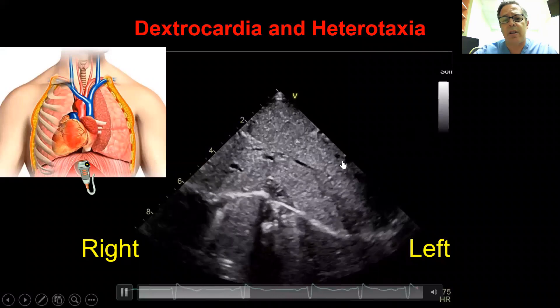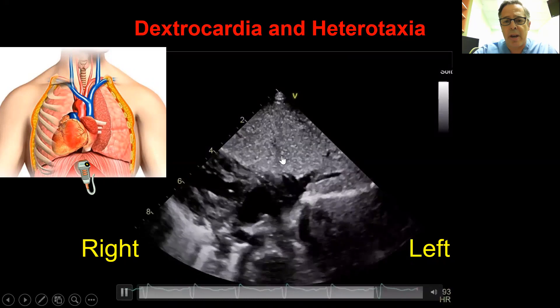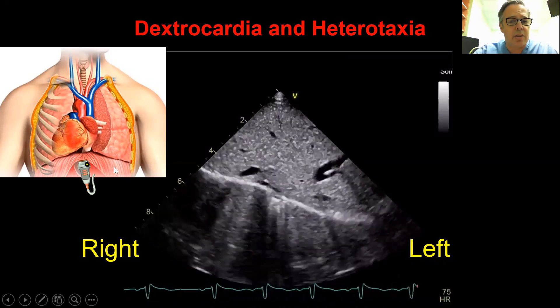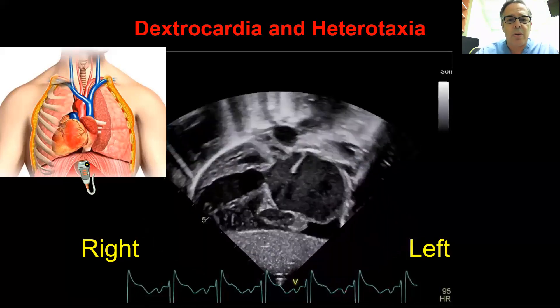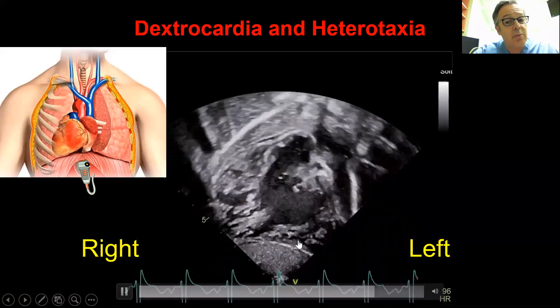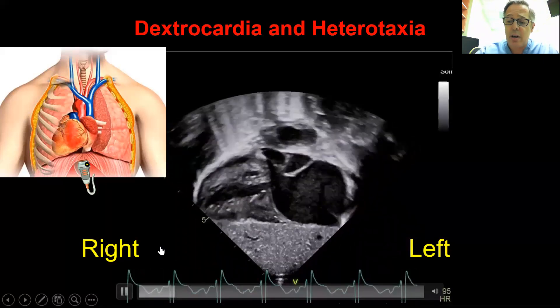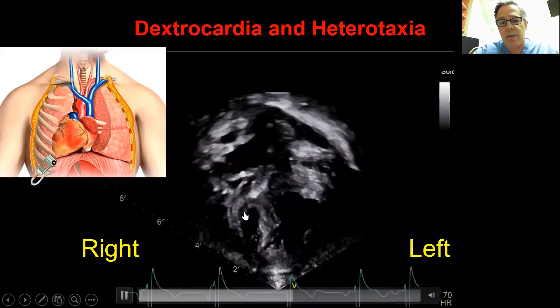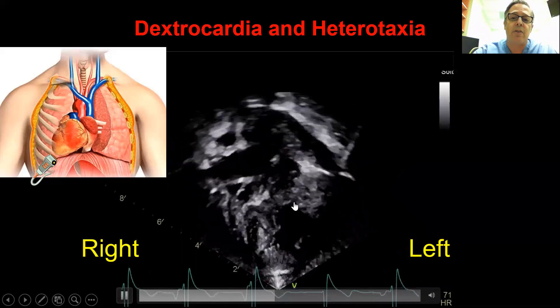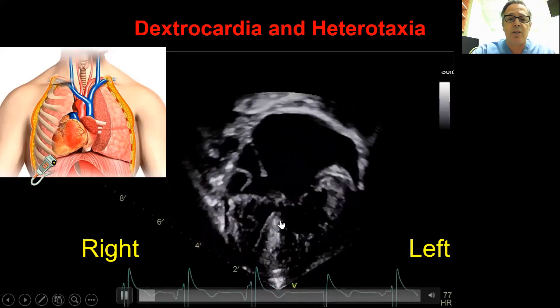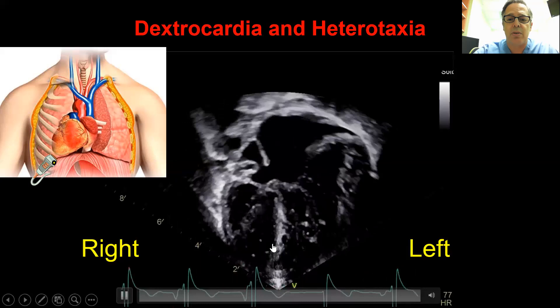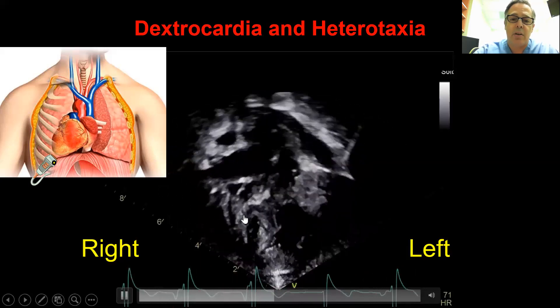This patient has left atrial isomerism. You see a big midline liver with symmetrical hepatic veins draining into a common atrium, and dextrocardia with the heart ending up on the right. The probe is placed with the marker pointed to the left. In the apical view, the RV is on the left and the LV is on the right — inverted — and sweeping up we see the vessels come off that RV in a double outlet right ventricle arrangement. This is a complete AV septal defect, and the ventricular arrangement is clearly visible: a heavily trabeculated RV on the left and a smooth-walled LV on the right.